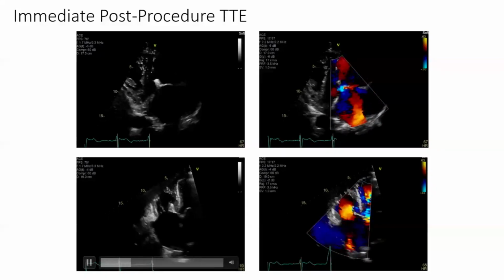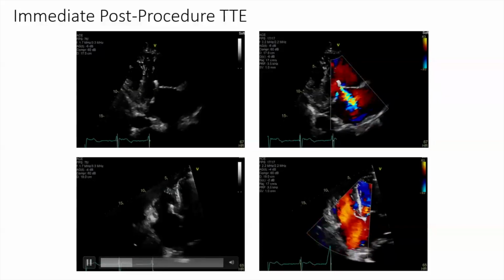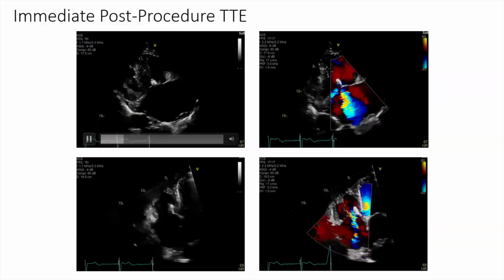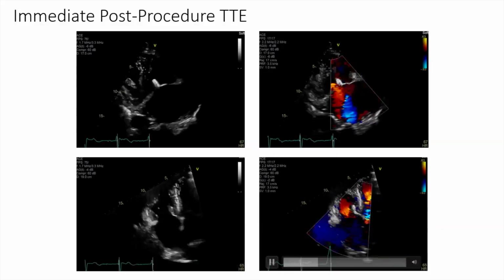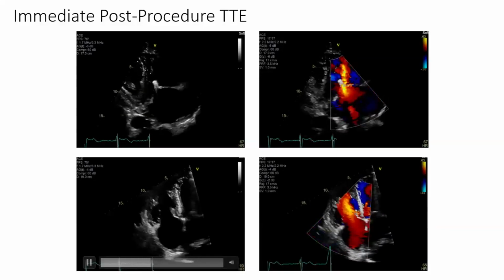And interestingly, because of the position of that clip in that commissure of the anterior and septal leaflets, it almost looks like it's attached to a single leaflet, where in fact it isn't. It is attached, as we can see in the inflow view, to both of the leaflets, but it's not attached to the posterior leaflet. Or the septal, the other parts of the anterior leaflet, sorry.